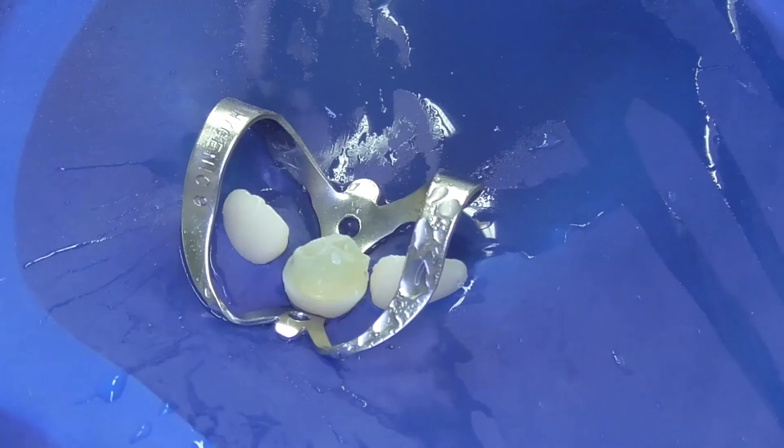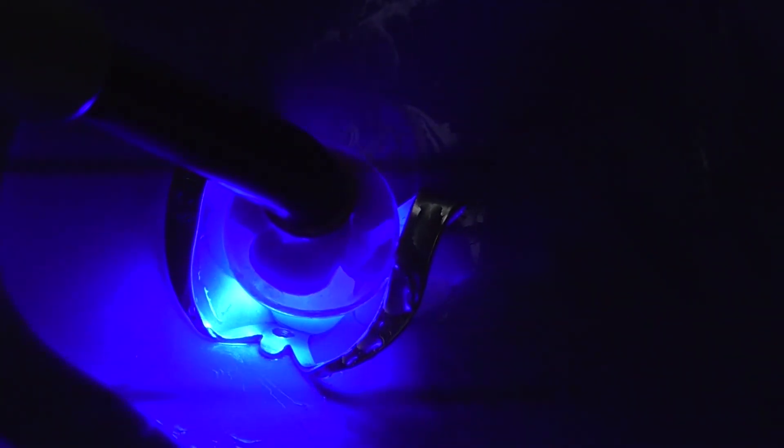After cutting the fibers, exposed single glass fibers of the post will be used for transmitting and scattering the light from the post to the matrix, which will be completing and finalizing curing of the post.